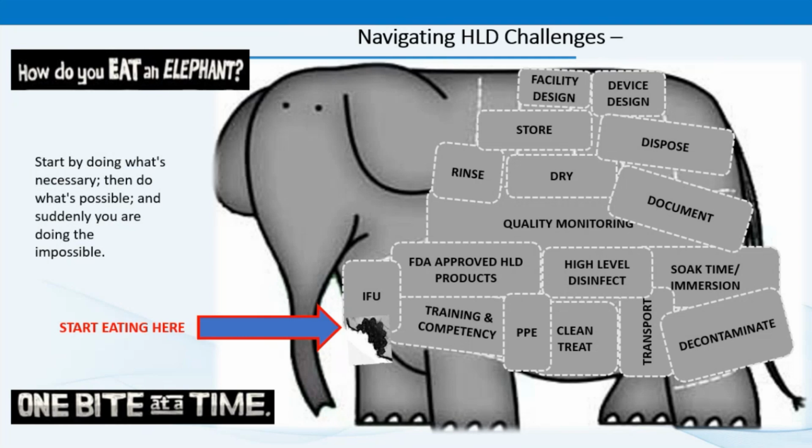High-level disinfectant is affected by many factors: organic matter, soap, lint, cotton sponges, and even the minerals found in water. They can all inactivate the HLD. Then there's evaporation, light, pH, time, and temperature that can affect the disinfectant. And detergents that enter the disinfectant solution can alter the solution's pH and reduce its effectiveness.